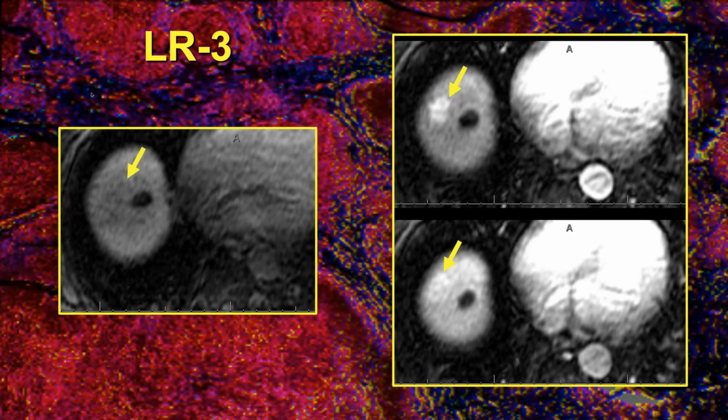Now, if we just look at that top right, we see some hyperenhancement way at the periphery of the liver. And if this was the only image that showed it, we may consider giving it LI-RADS 2 for arterial portal shunt. But hopefully this projects well enough on your computer, but if you look at the image on the left, this is the T1 weighted unenhanced image. There's some slight hypointensity, which I find a very useful feature for bumping from LI-RADS 2 to 3. Perhaps it should have been called an ancillary feature, but there were reasons it wasn't. And it's persisting a bit on the late post-contrast.